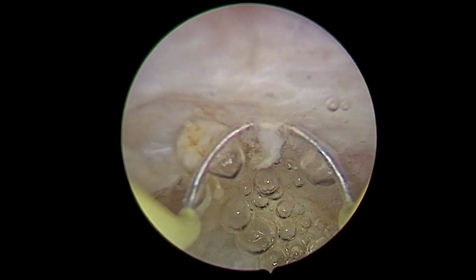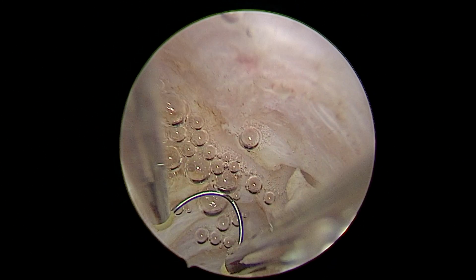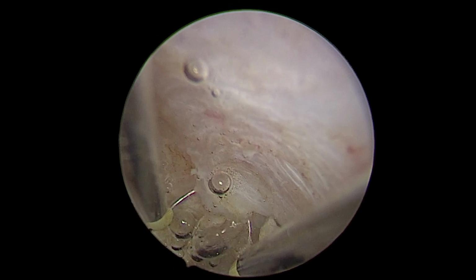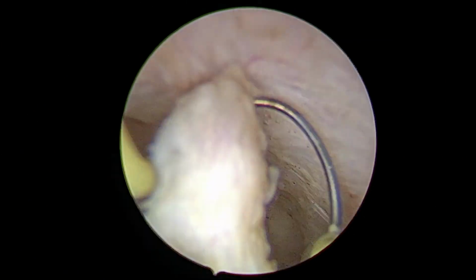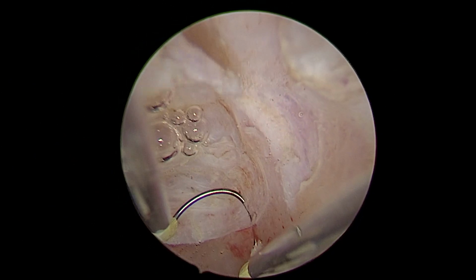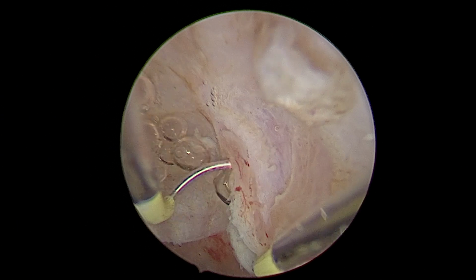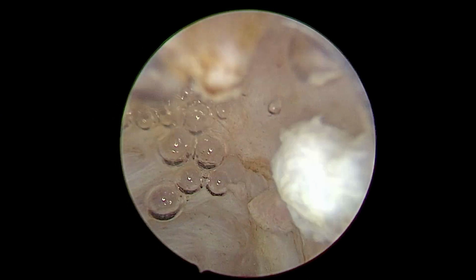Another technique of isthmocele correction is by laparoscopy. It is done when the residual myometrial thickness is less than 3 millimeter, because if you try to correct that isthmocele, which is also called the severe isthmocele, then one thing is chances of perforation will be more if you go by hysteroscopy approach. Second thing, the strengthening of the scar won't be possible by hysteroscopy, which is possible by laparoscopy route.